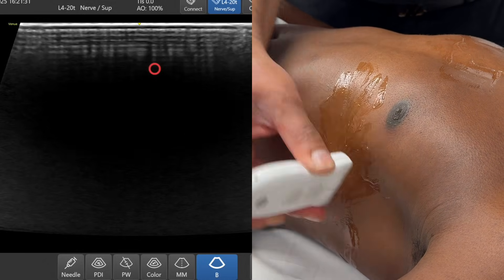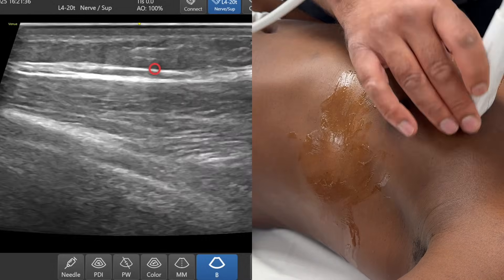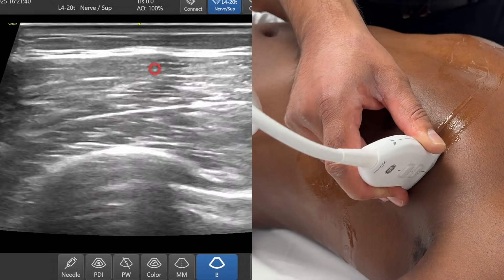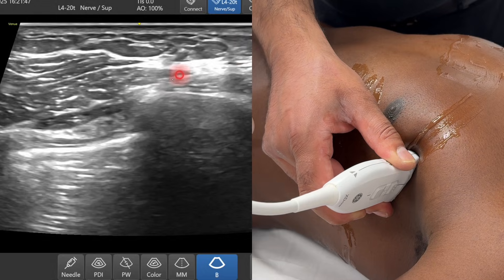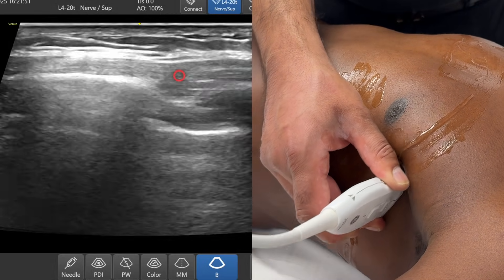Just to show you the connectivity with the front of the chest — if I slide up onto the front of the chest, we've got pec major here. As I'm sliding laterally, you're going to see pec major end, and the muscle below it is pec minor. As pec minor ends, you're going to start to run into serratus. You can see how it's continuous.